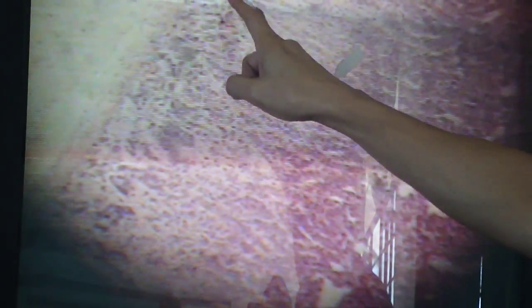We divide the adrenal cortex, the majority of which is in the middle. It's called the zona fasciculata. And the one that forms glomerulus-like structures, zona glomerulosa. And then here you have your zona reticularis. So again, zona glomerulosa, zona fasciculata, zona reticularis.